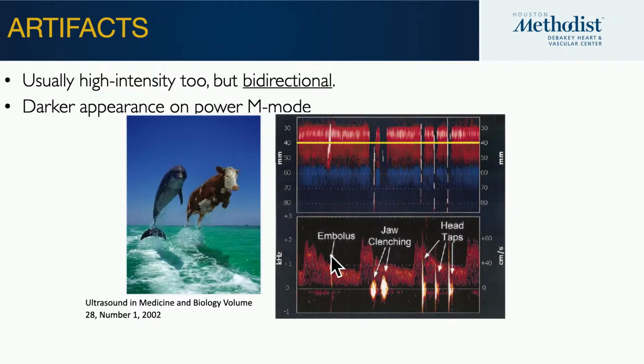And again, it's a beautiful computer algorithm. If it's a not moving particle sitting on a zero line, it has multiple depths deleting that signature so you don't pay attention to them, and it tries to remain black instead of nice and bright and white, so that high intensity signal doesn't bother you. When you see this black, you know that this is just an artifact from a zero speed something on your spectrum.